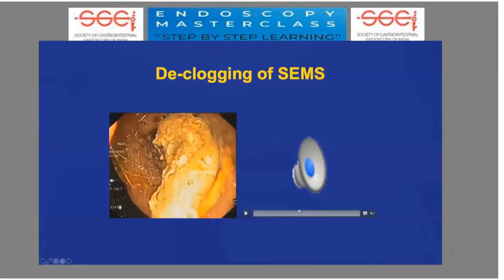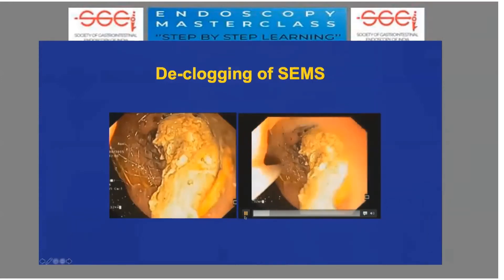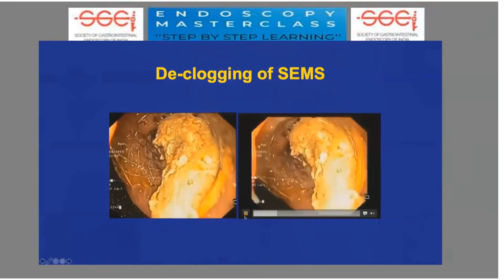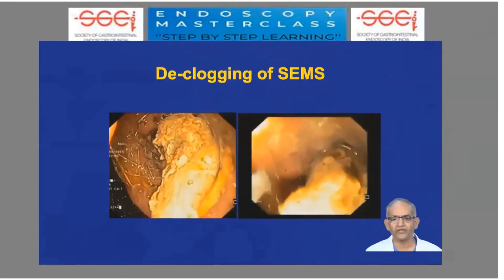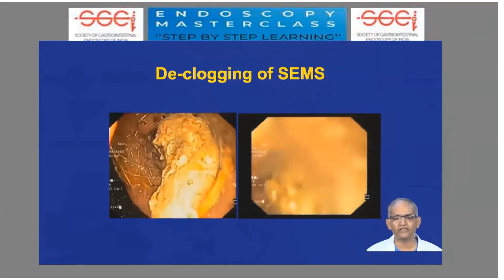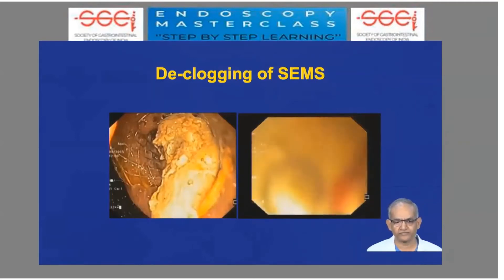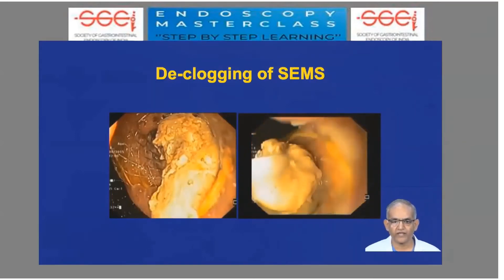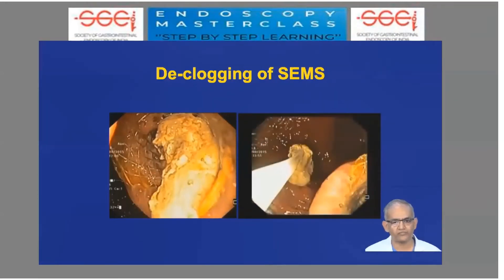For the first step, if debris is occluding the lumen of the metal stent, you can gently tease it out with a snare. That itself solves most of the problem if the inner cavity is clean and there is no more loose debris inside.